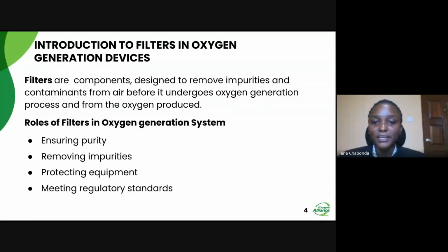And filters also protect oxygen generation devices by preventing foreign particles from entering and potentially causing damage or reducing the efficiency of the system. And this helps to maintain the longevity and also the performance of the oxygen generation systems. Filters also help in meeting regulatory standards. So health facilities need to adhere to strict regulatory standards for the quality and safety of medical gases, including oxygen. And filters play a great role in ensuring the compliance with these standards.